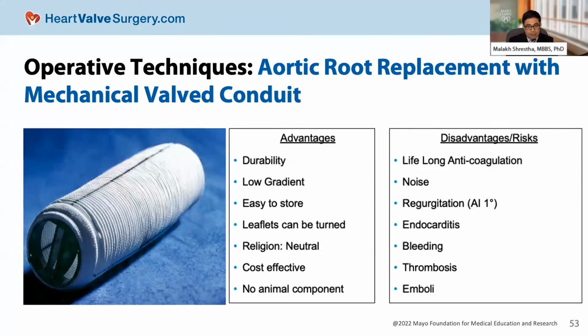The disadvantage is that one has to take lifelong anticoagulation with warfarin. And some patients, not all, do complain that they can hear the valve noise. And the third one is that these mechanical valves still leak a bit, so it will never be totally competent. And of course, the other thing is that one has to be careful that these valves don't get infected, so if one has such a valve and needs to visit, let's say, a dentist or have any invasive procedure, one has to take antibiotics beforehand.